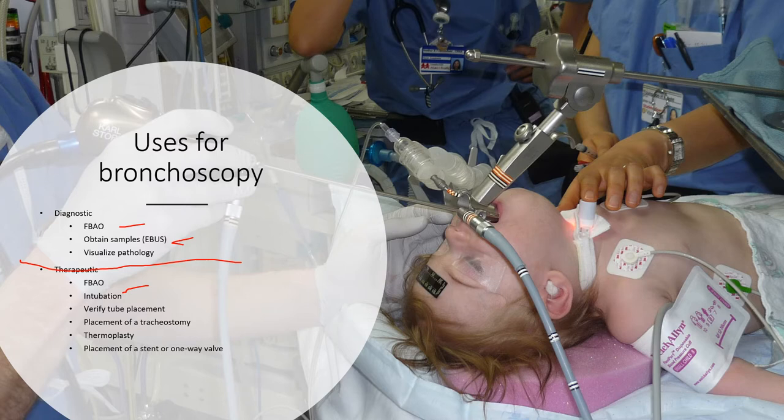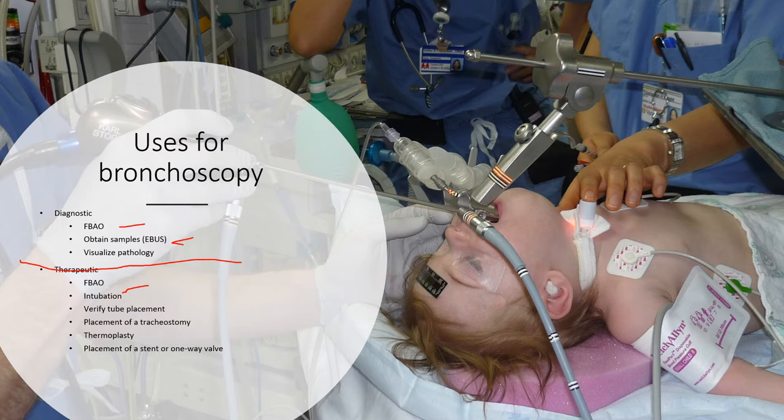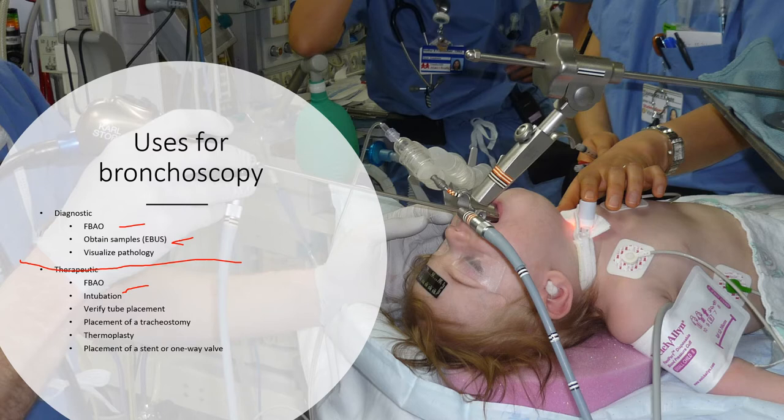We have options of BALs, brushes, and forceps. There's also something called a bronchwash, where instead of wedging the scope like a BAL, you stay in the trachea — let's say you see a ton of secretions and want to get a sample for a culture. You just suction in the main airway. It's not specific to any lobe or segment, and we send that as a bronchwash.